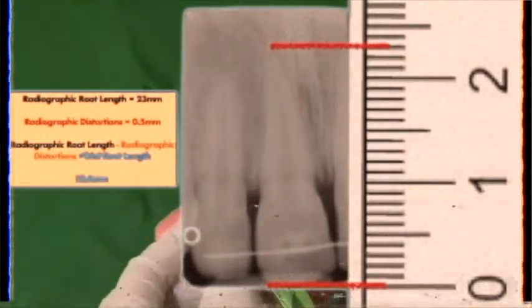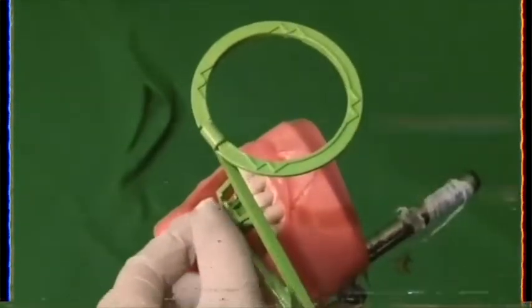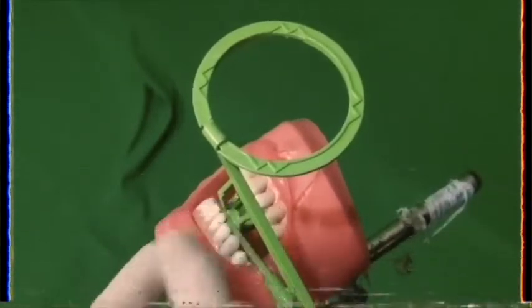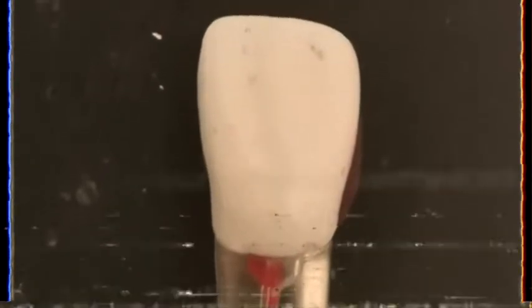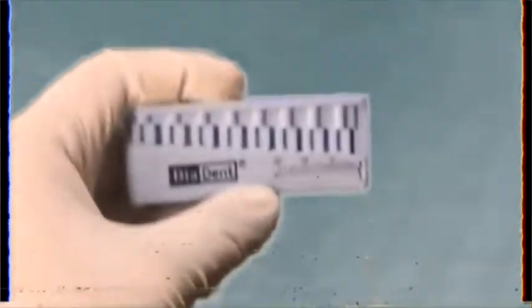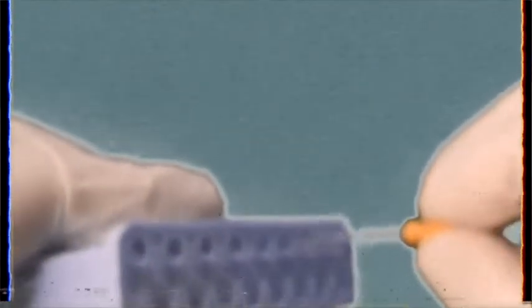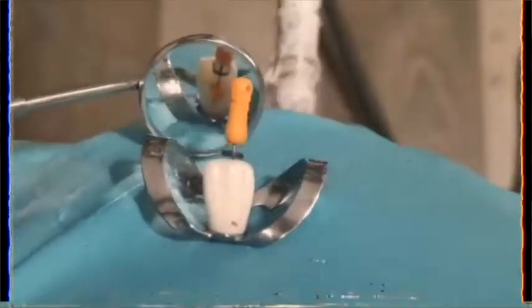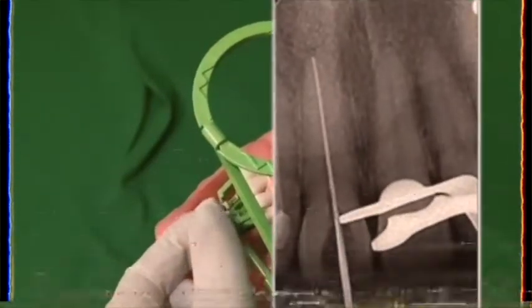Now that we have obtained the trial working length, we will now use this measurement to achieve full exploration of the root canal, or what we call apical patency. We establish the incisal edge of the tooth as the reference point with a rubber stopper. Using the endodontic measuring block, we can pre-measure our files before exploration so that we may not extrude beyond the apex. Once our rubber stopper touches the incisal edge, we can take a radiograph to reconfirm our trial working length.